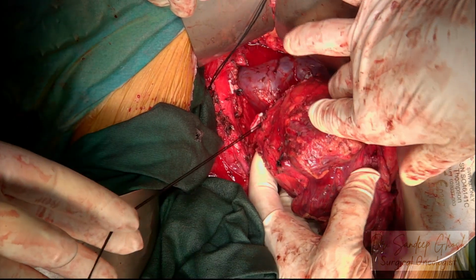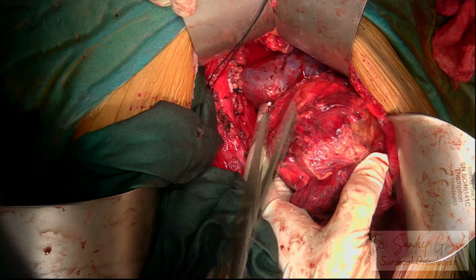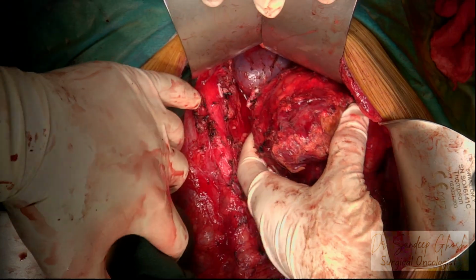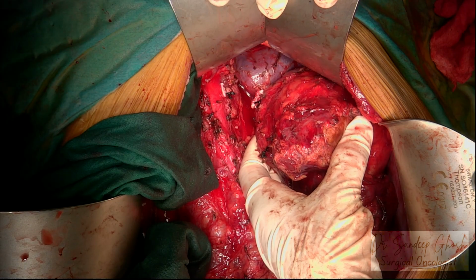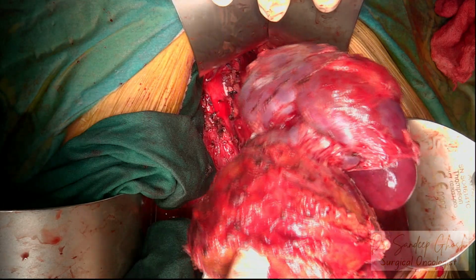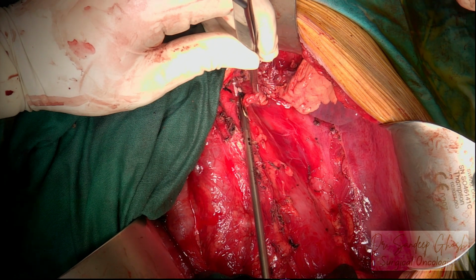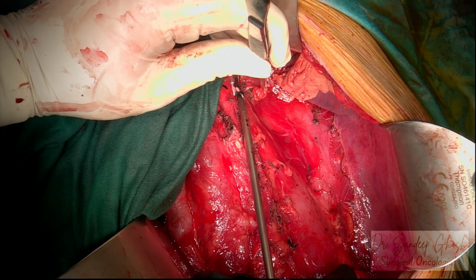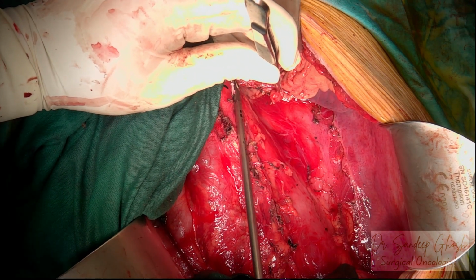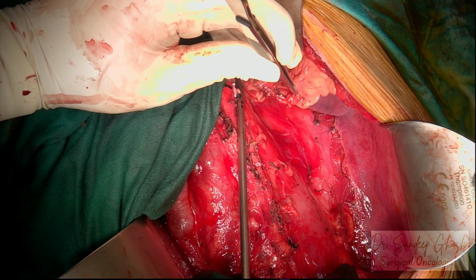Now the posterior dissection and the attachment with the spleen is not shown in this video. So the entire specimen is now free of any attachment and is being removed. Now we are moving ahead with the rest of the RPLND template dissection. Now the residual remnant left paraaortic lymph nodes are being removed here at the hilar region.